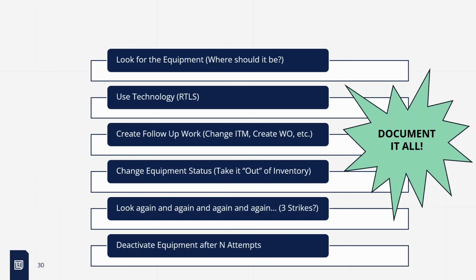Yeah, and with some CMMS, if you track it at the model level, start at the model when you're adding a new company or model. Again, if somebody doesn't look for that and track it, a lot of times you do have to have some manual knowledge of what your data is before you just start adding it.